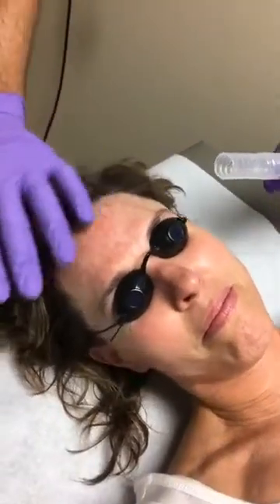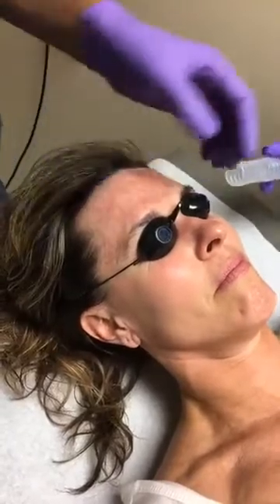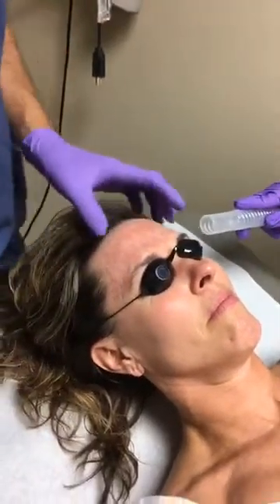This nice ring that we get over here across the board is what we want to see. That is going to take sun damage, fine lines, and wrinkles off.